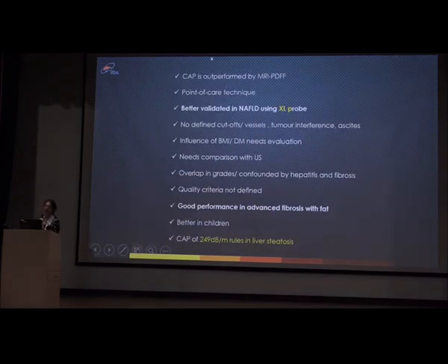So what are the pros and cons of CAP that you're doing here? CAP is outperformed by MRI PDFF by its sensitivity and specificity, no doubt about it. But the plus is it's a point of care technique. It's the first thing that you can do when a patient walks into your OPD.